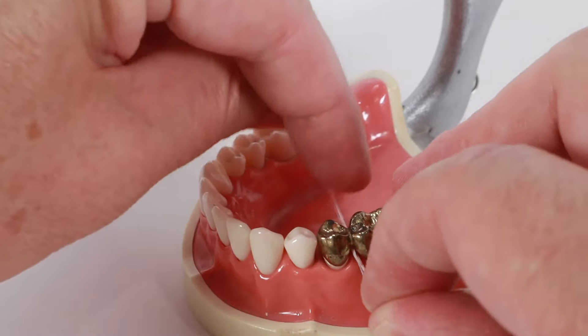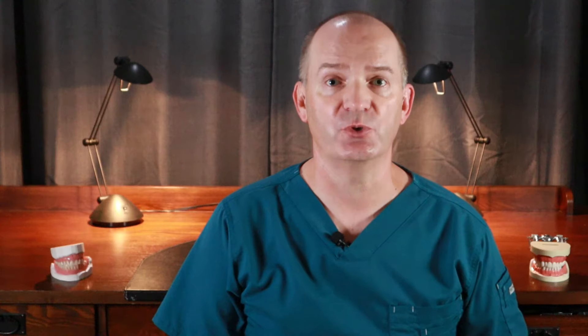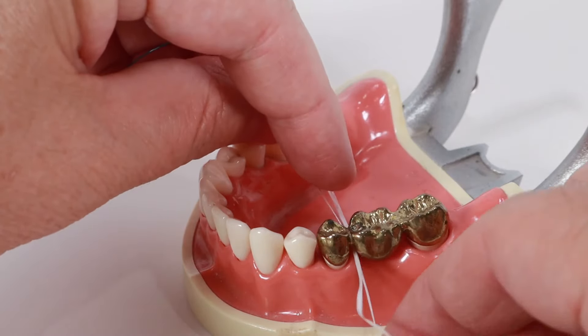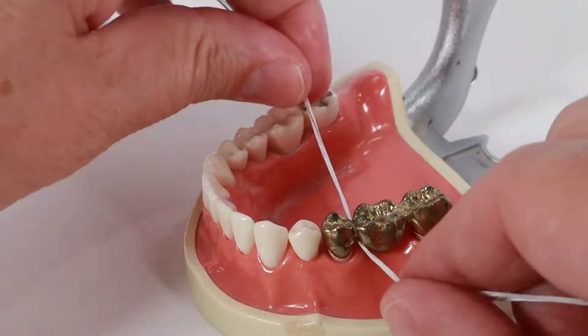First, rub the floss on the underside of the false tooth a few times. Remember, you are trying to scrape off the plaque that may be attached there — this is an area that you can't reach with your toothbrush. Once you do that, slide the floss forwards until you are up against the front tooth of the bridge. Now you scrape the floss up and down the side of the tooth a few times. Make sure to wrap the floss around the tooth a bit and slide it up and down. Don't move the floss back and forth like this — that doesn't clean the tooth at all.